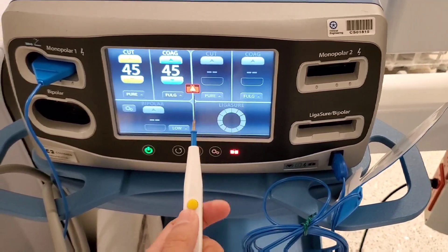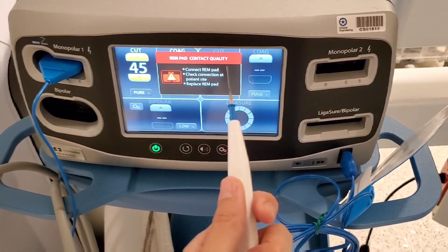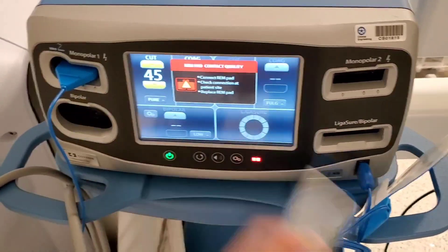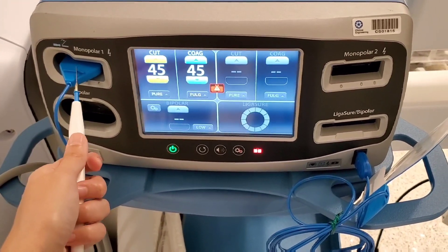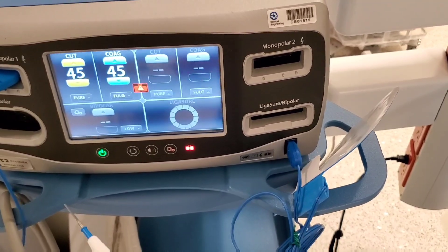And if something happens, you can check the REM pad first, then detach and attach it again, or just scrap the whole thing — either or, whichever one you feel is the most priority. For me, I always just get a brand new bovie. And if that doesn't work, obviously my last resort is to replace the bovie pad. And that's it.